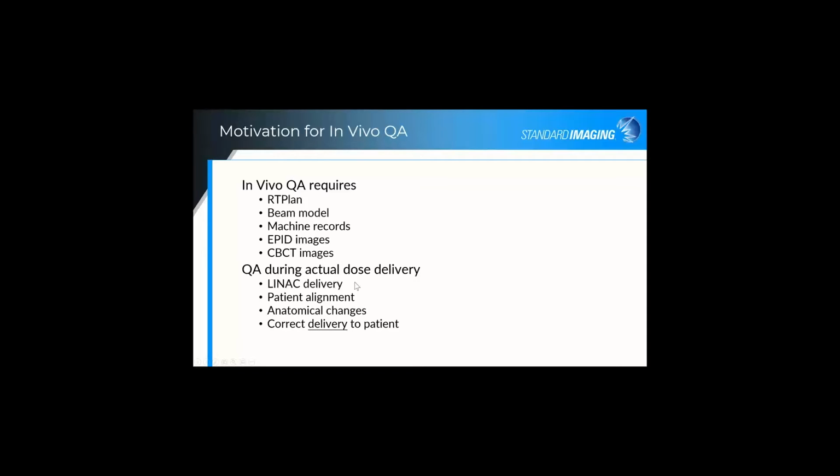And this QA during the actual dose delivery brings in a QA of the LINAC delivery itself, the patient alignment, and anatomical changes, so that all of these items are checked in order to ensure that the correct delivery has occurred for the particular patient and is logged.